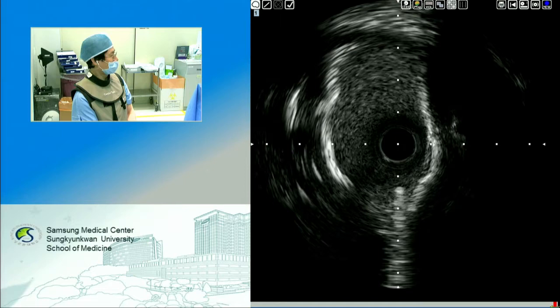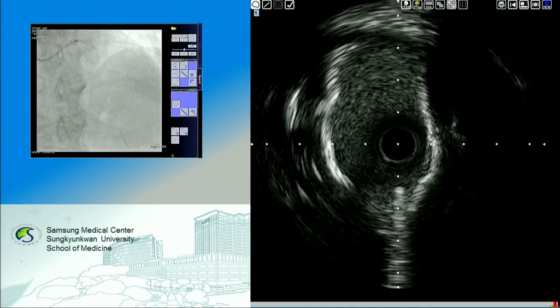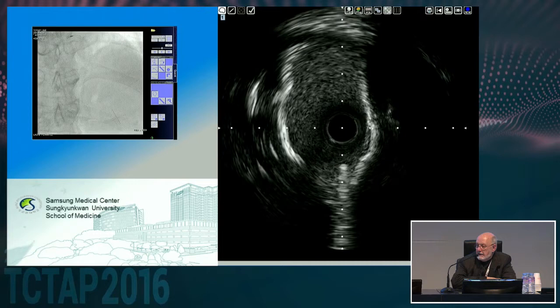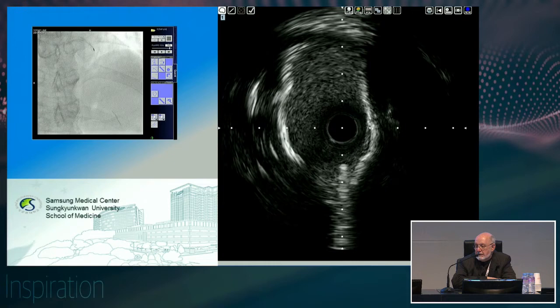What do you think about the IVUS findings, Dr. Gary? Well, first of all, the left main is diseased, but it's not stenotic. And the disease seems to extend most of its length. The thing that worries me most about the circumflex is the attenuated plaque in the proximal vessel, which has a higher frequency of distal embolization. It doesn't mean you'll always get distal embolization, it just has a higher frequency, and it's something you have to keep in the back of your mind. And the circumflex is a big artery.